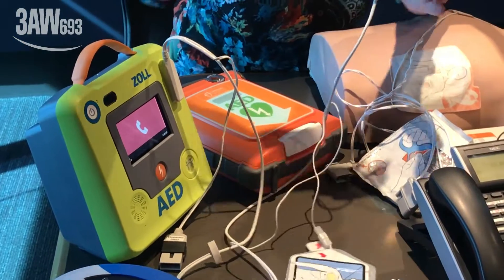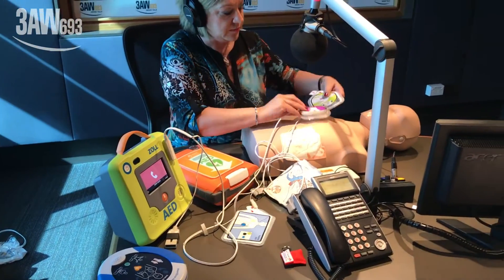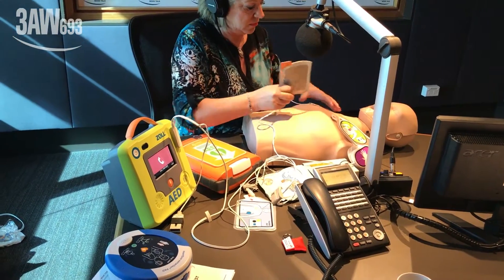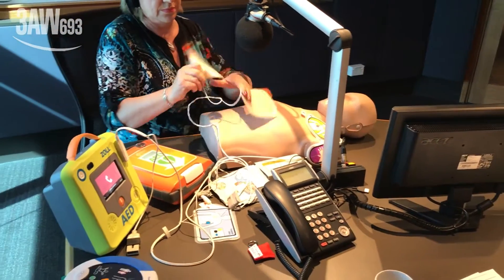The Zoll AED is nice and loud. It will give compression information when you put it on the patient. It says: 'Stay calm. Check responsiveness. Call for help.' An impressive and easy-to-use device.